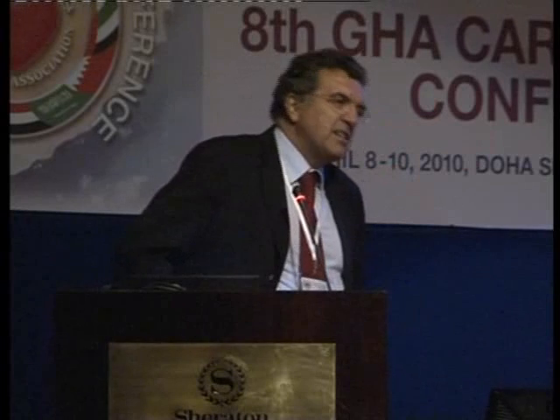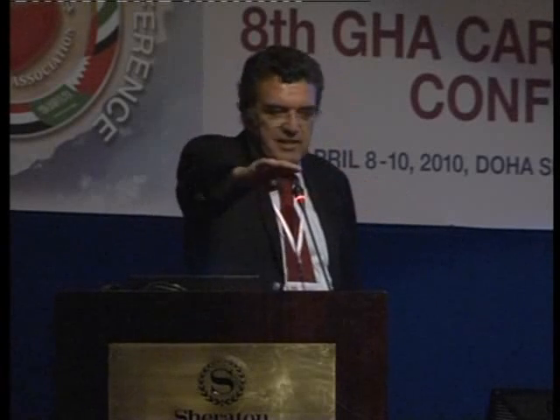Other questions concerning the technical points of FFR? What is interesting, and this was perfectly shown during this measurement, is the repeatability, that is the consistency of the result. They took the first check at 0.85. They redid it and got 0.85. If you redo it 10 times, it would be 0.85, 0.84, 0.83. But it's really consistent. This is maybe, for me, the most interesting thing: when you do one check, you can be sure that the second and the third will be exactly similar.